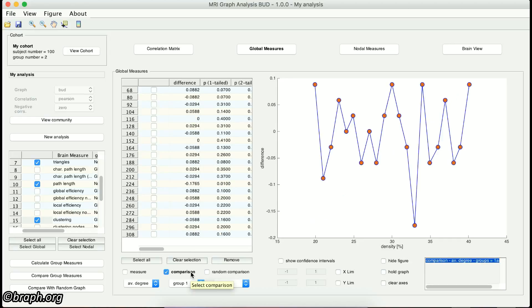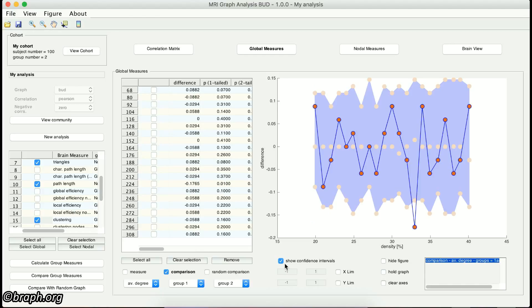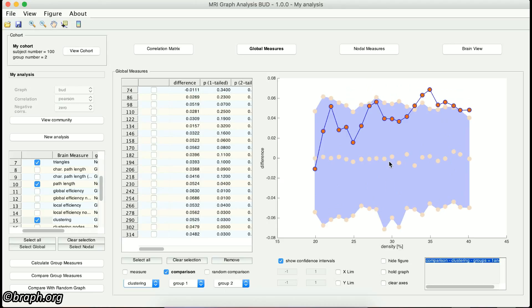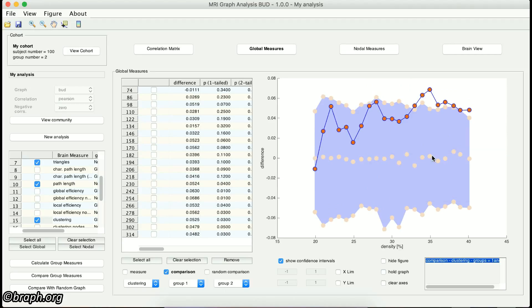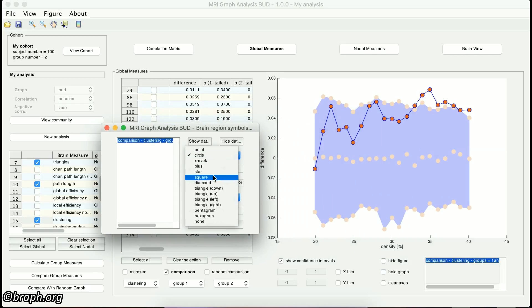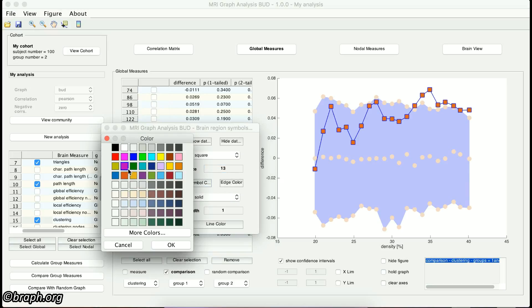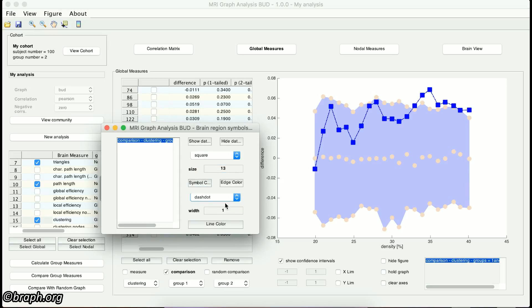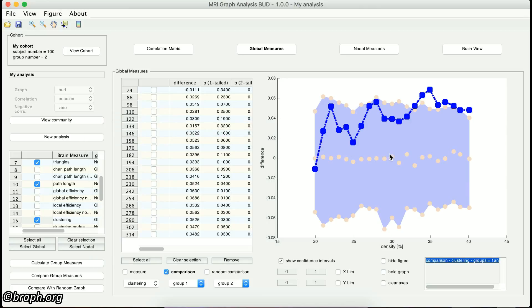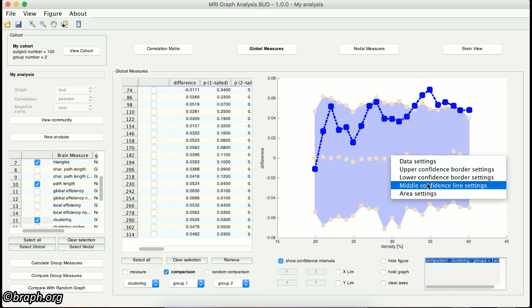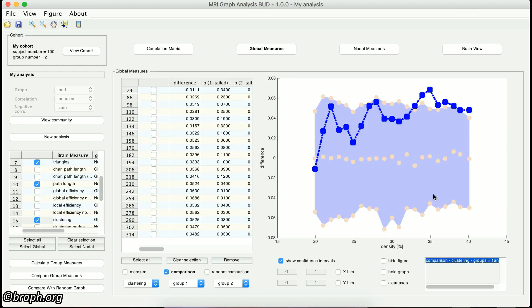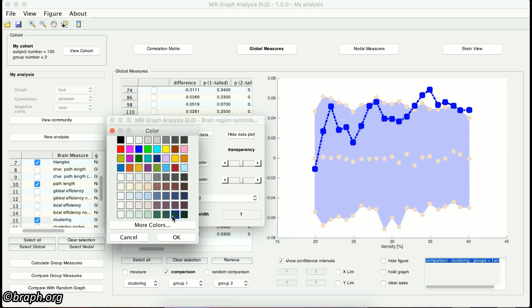Finally, if you visualize the comparison or the random comparison analysis, you can also check whether your results are significant by clicking on the Show Confidence Interval checkbox. If you right-click on the figure, you can see other actions provided for better visualization of the data. By selecting the Data Settings option, you can modify the style of data representation by changing the color, type, and size of both the line and the symbols. You can also modify the style of the upper and lower limits and the middle line of the confidence interval, and change the confidence interval area by changing its face color, edge color, and transparency along with its line style and color.